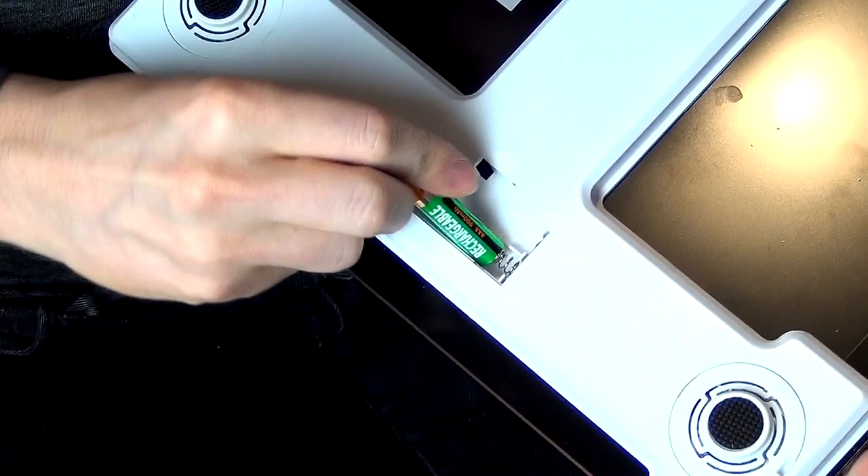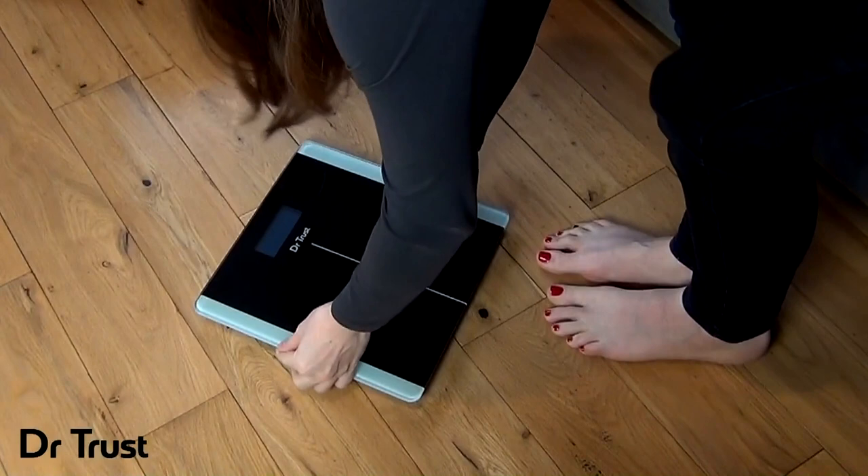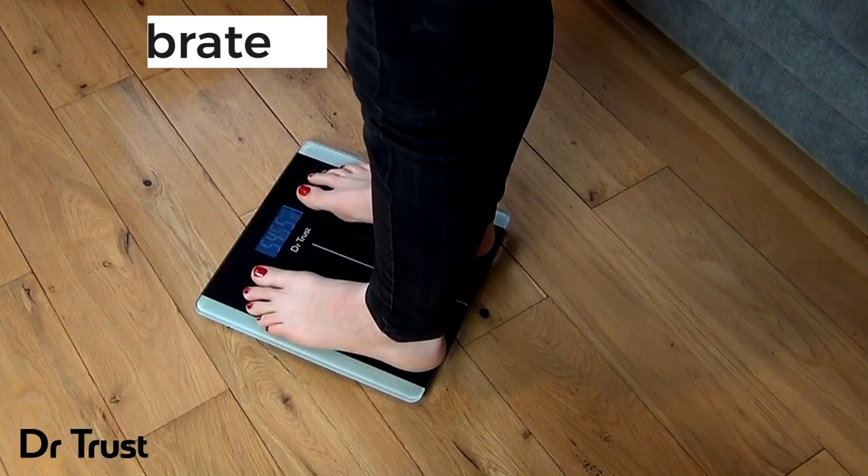Simply insert two AAA batteries and you're ready to go. To get started, simply lay the scale on a hard flat surface, step on and off to calibrate and disregard this calibration reading, then you're ready to weigh.